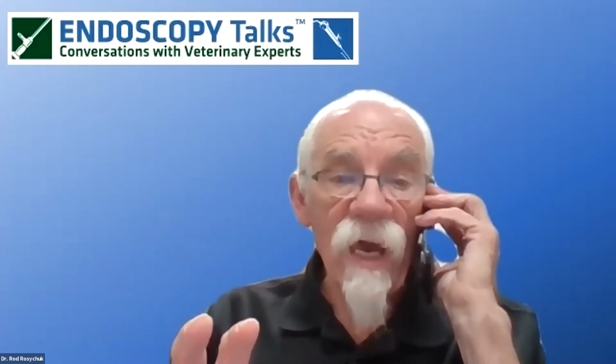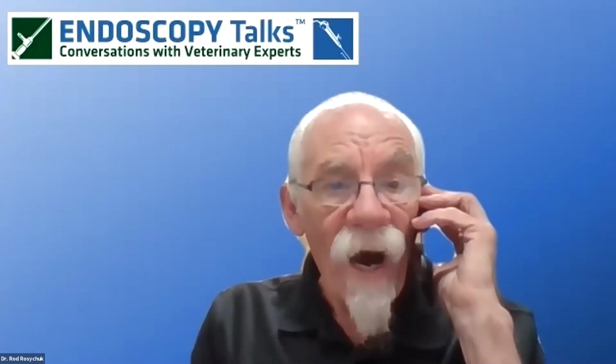I might add, in middle ears, it's not uncommon for me to see some whitish opalescent epithelial debris that accumulates in patients with chronic otitis media. If I can't get all of that material out of a middle ear, I don't worry about it. Flush large volumes of fluid through the middle ear, and a lot of that stuff biodegrades and takes care of itself.